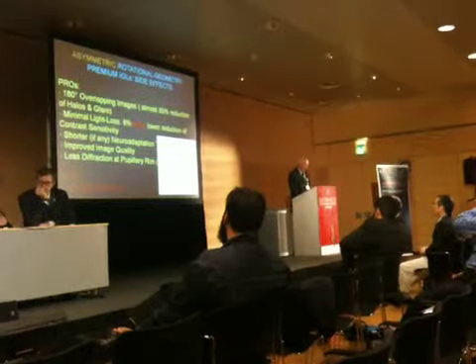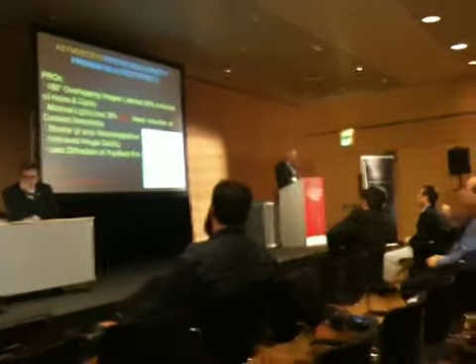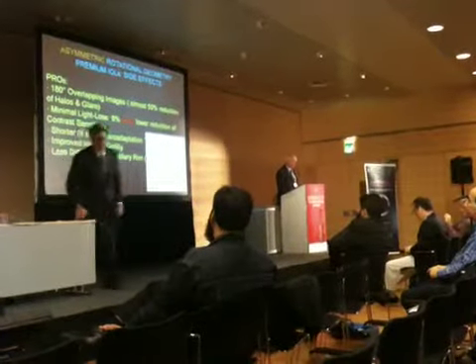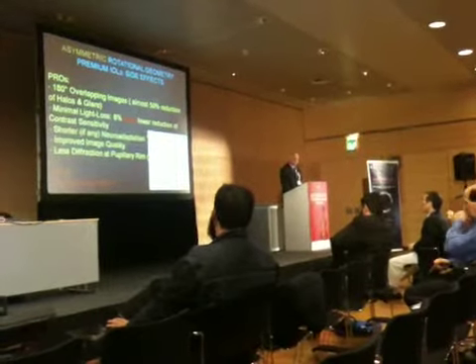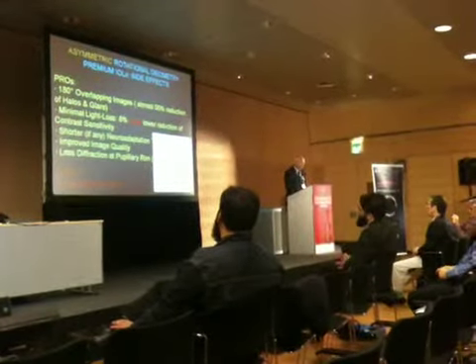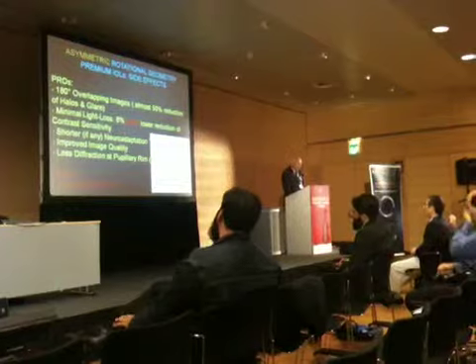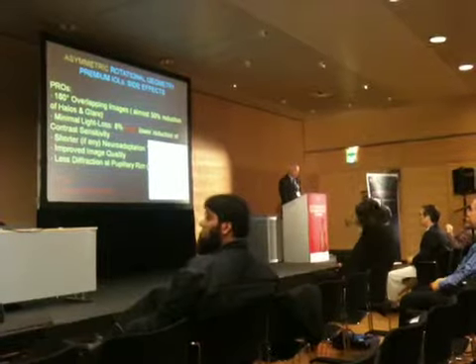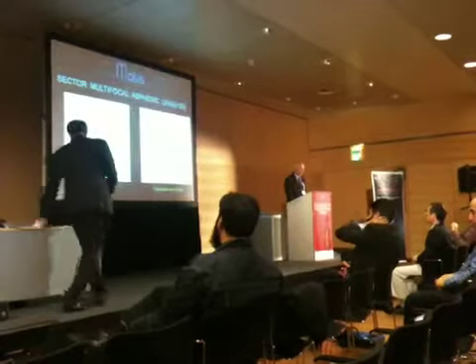So we have some pros: we have only 180 degrees overlapping imaging, so we can say that there is almost 50% reduction of halos and glare. There is a minimal light loss, 8% only. This data comes from the company, but has been demonstrated by Professor Hoffer. So we can have a low reduction of contrast sensitivity. There is shorter or no neural adaptation time, improved image quality, and since there are no rings, there is less diffraction at the rim. On the other side, we have to orientate the IOL in the bag.